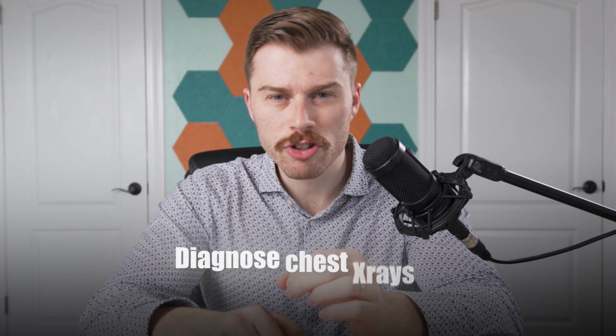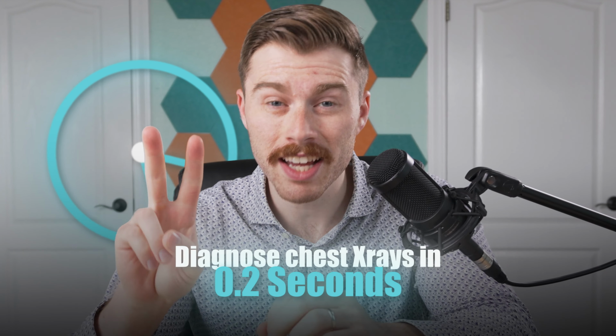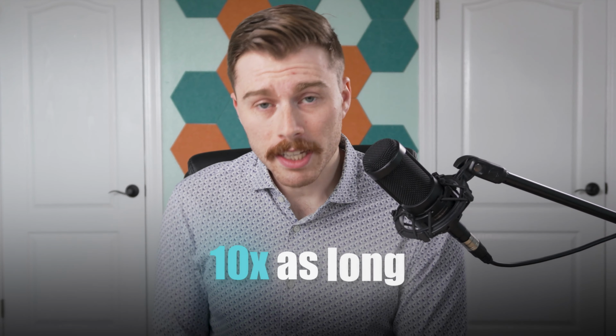Radiologists can diagnose chest x-rays in 0.2 seconds. This is how fast that is. Hang on, I think I blinked. If you didn't get it, that's okay. Honestly, me neither. What? Now I'm going to show you 5 images and give you 10 times as long.